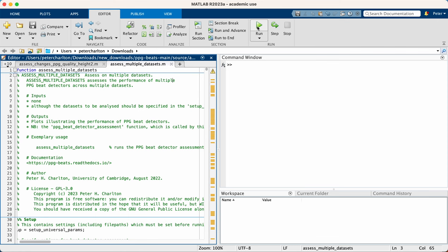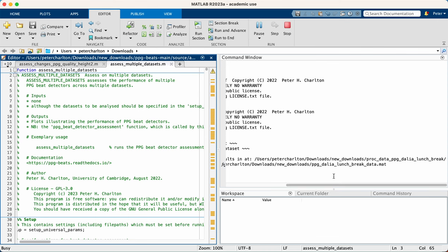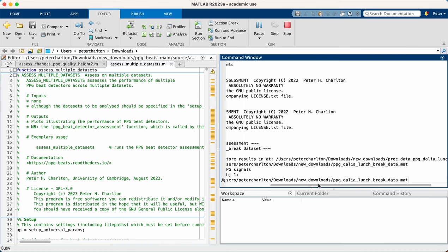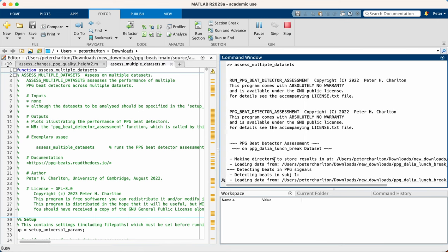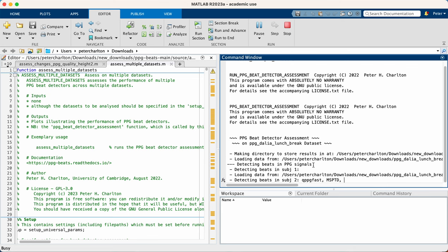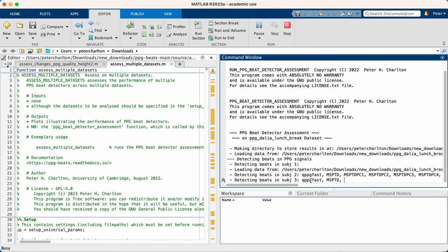So let's run that. And just to give you an overview of what it's doing. So it's cycling through each of the subjects in that dataset, taking the recording of PPG signals acquired during their lunch break. And then it's using multiple beat detection algorithms to detect beats in the PPG. And these are listed.